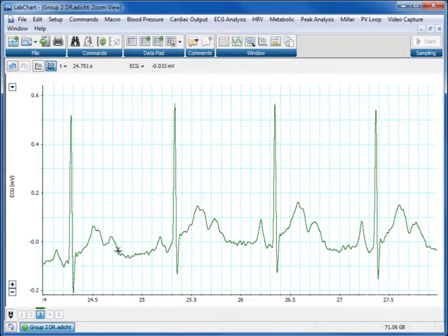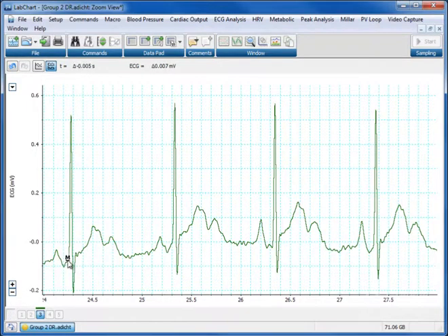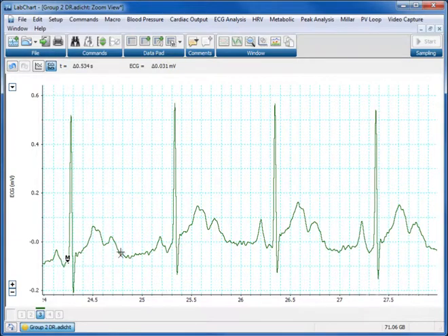That's a bit complicated and a bit difficult so we're going back to our little friend the marker, the M here, and we can drag and drop the marker on the beginning of the Q wave here, and then we can hold our cursor at the end of the T wave and it tells us that the time is delta 0.534 seconds, that's 534 milliseconds.